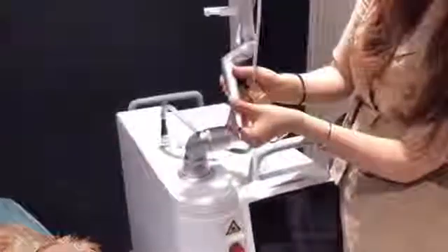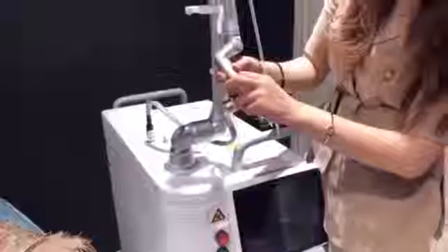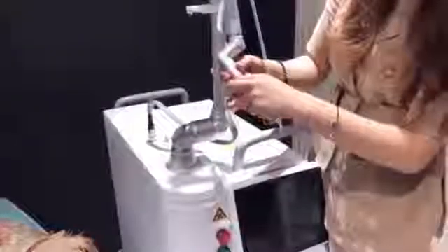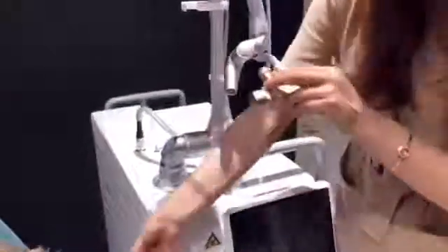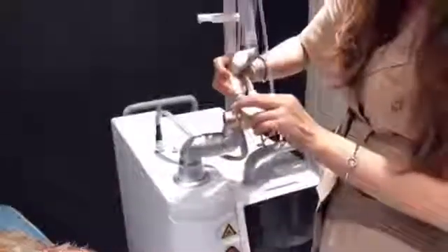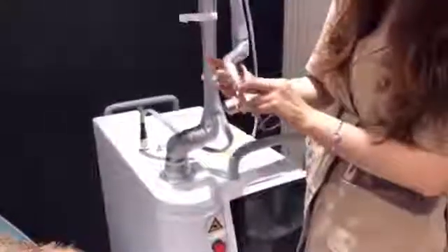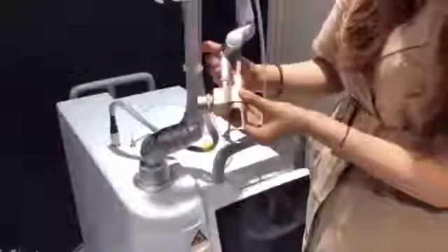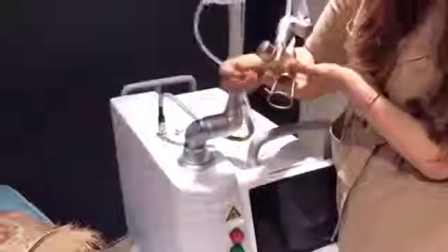Take off the cutting head, connect the fractional head, and connect the plastic pipe to the head.